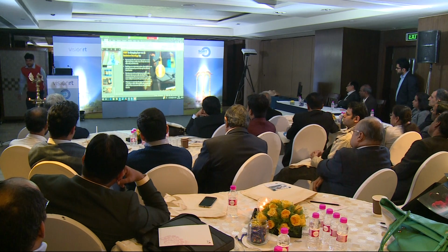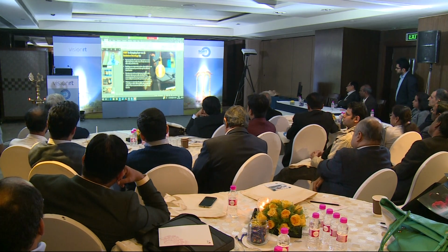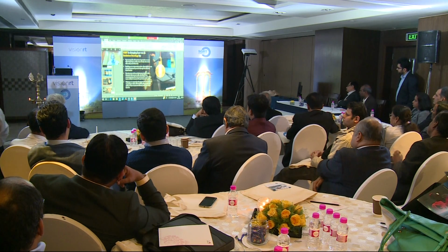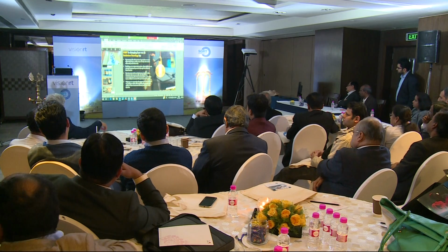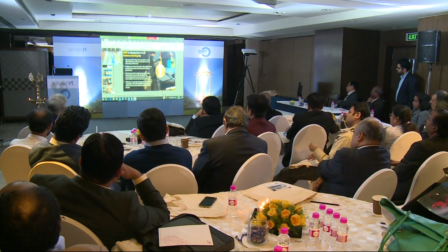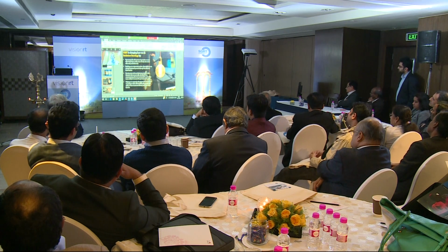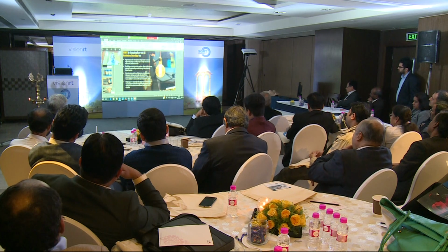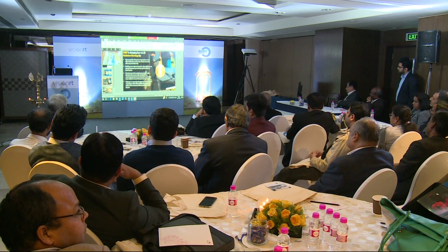Again, we're on slide 32. It also enables us to objectively review, then improve our current treatment process through its observer-based nature. So it's always our eyes in the sky. It's telling us how we're doing end to end, and it allows us to do that ongoing performance evaluation, constantly adapting how we do things, constantly addressing any immobilization issues proactively before the patient experiences the issue. We can identify it, and then develop more informed planning margins.